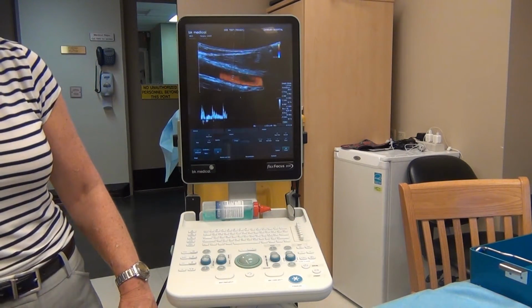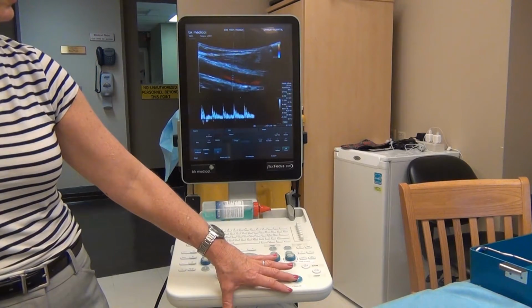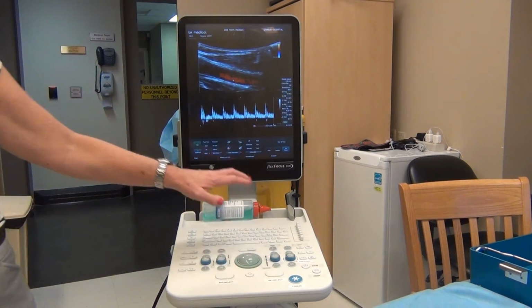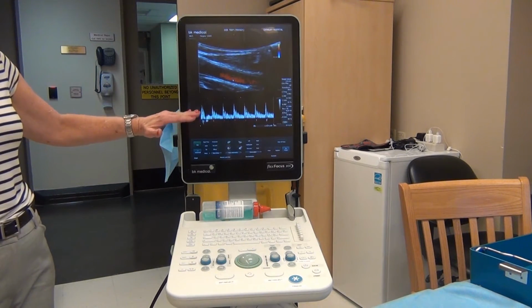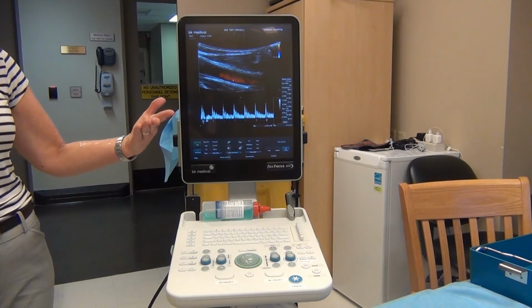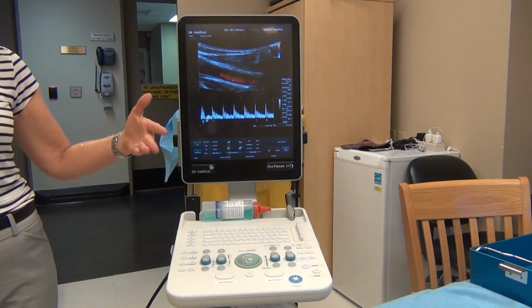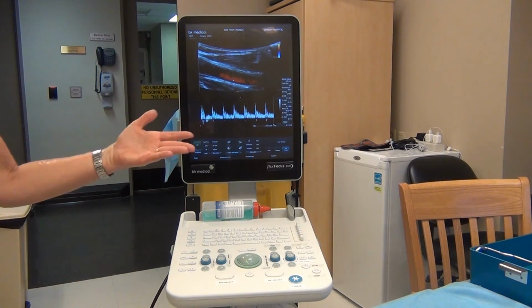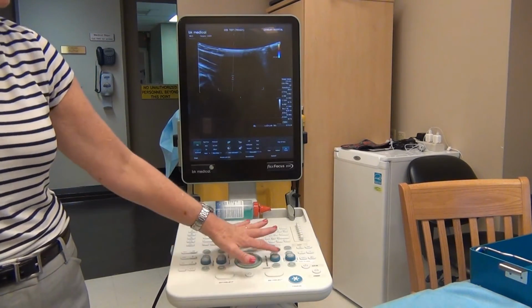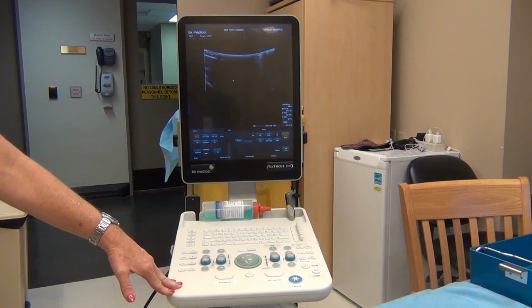When I hit the auto button, what that did is it automatically adjusted the scale and the baseline, so it's one extra step you don't have to do. The doctors may want to do it just to see if something is arterial or venous. To get out of it, we're going to unfreeze and just hit B to go back to black and white scanning.